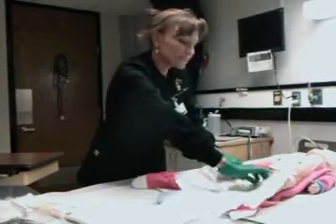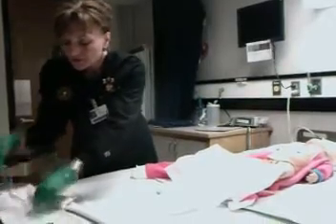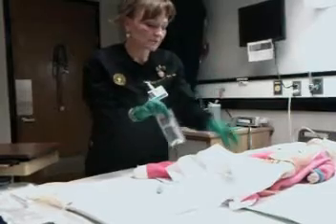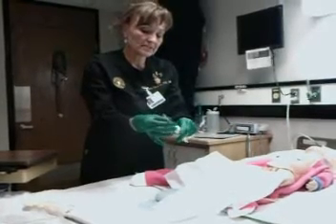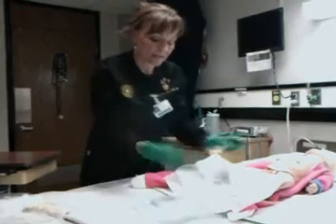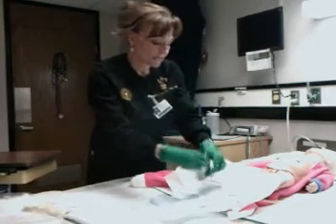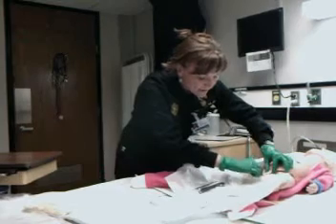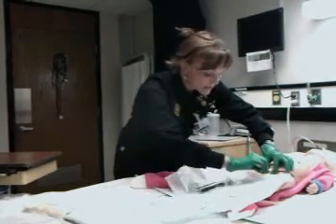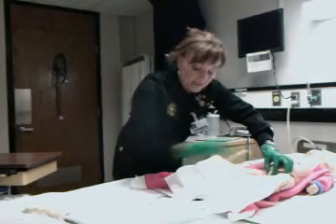As mentioned earlier, I have my povidine iodine swab sticks — KY we will not use on the baby. I'm going to go ahead and open everything and get my catheter ready to go. The lid is tight, so loosen it a little bit. Here's your protective cover; I'd probably keep that on until we're ready to assemble. Everything is brought into close, handy range. Then — while I'm still sterile — I'm going to open the labia. Cleansing the meatus on an infant is similar to adults, though everything is very tiny. My left hand is on the area and I will not change it. I'll advance the catheter straight in until I get urine.